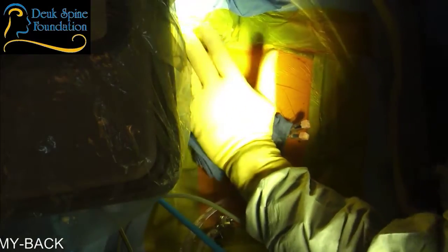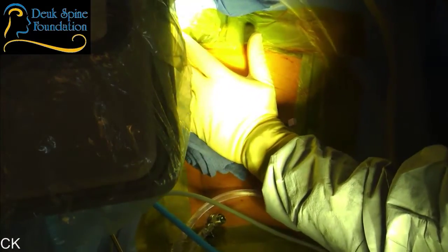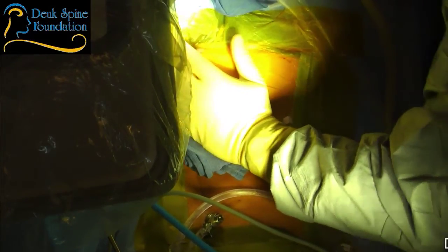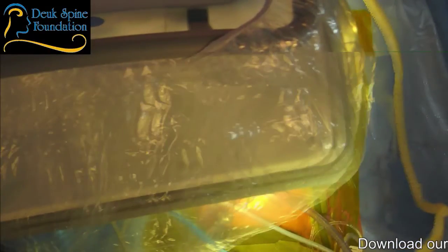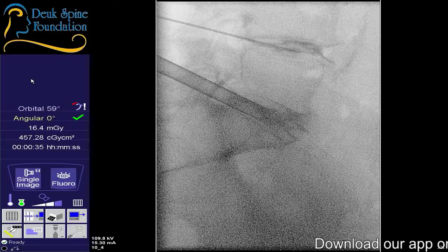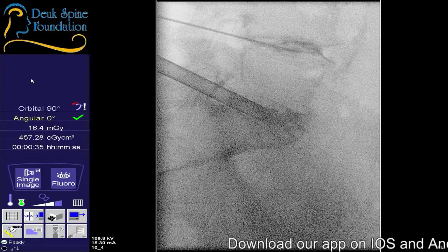What are we listening to, a talk show? No, we're in actually. All right, let's get our flow back in. Pressure. What is this, Delilah? We're going to put a herniation on.